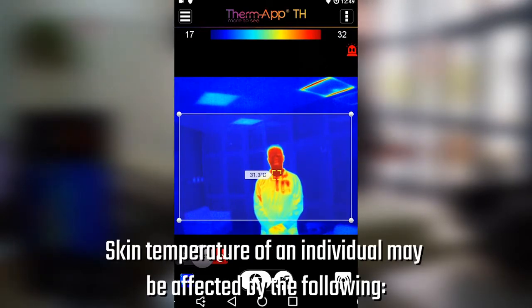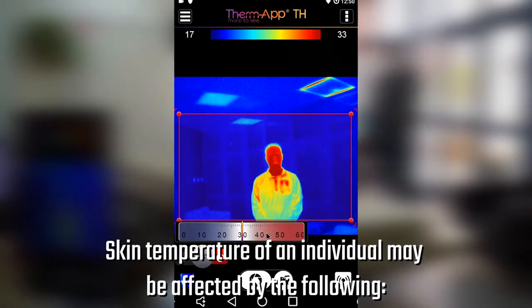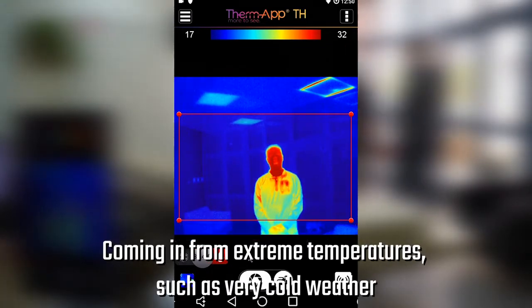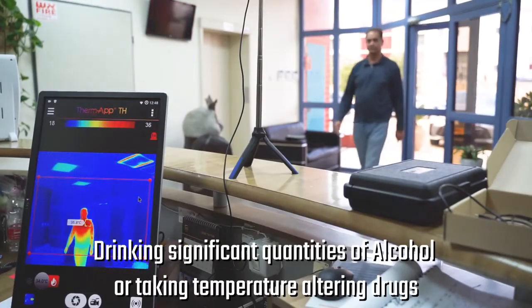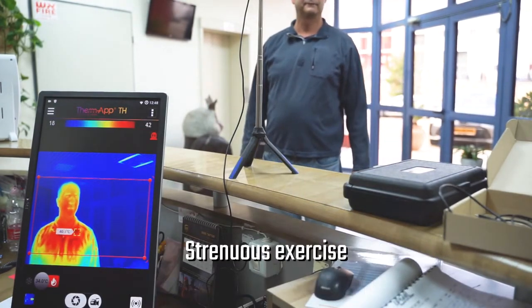Important: skin temperature of an individual may be affected by the following: coming in from extreme temperatures such as very cold weather or right after standing next to a heater, drinking significant quantities of alcohol, or taking temperature-altering drugs, strenuous exercise.